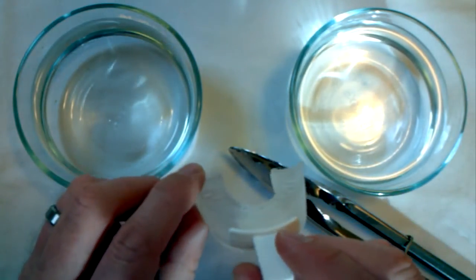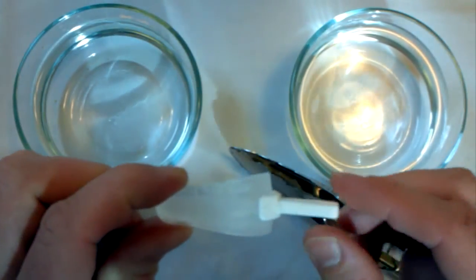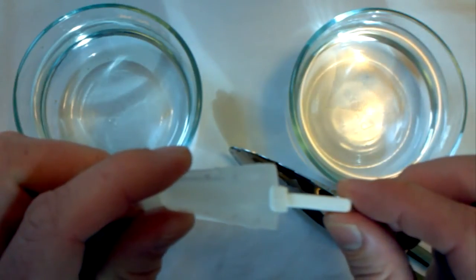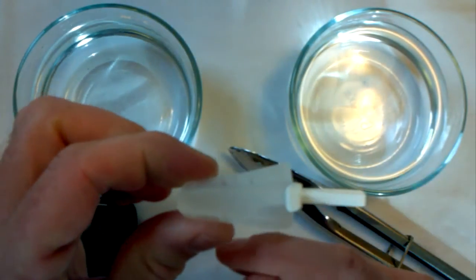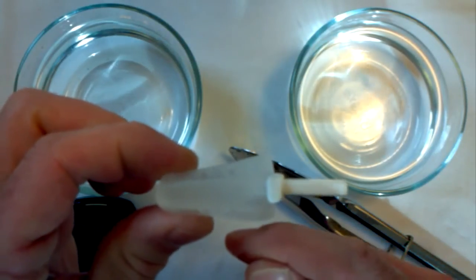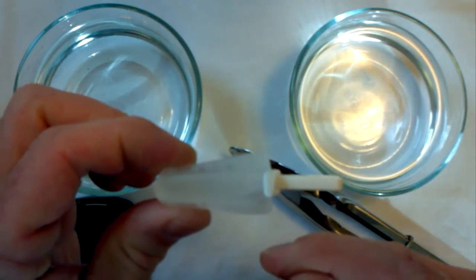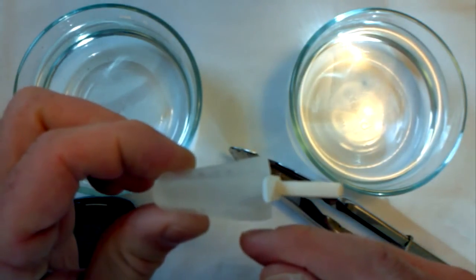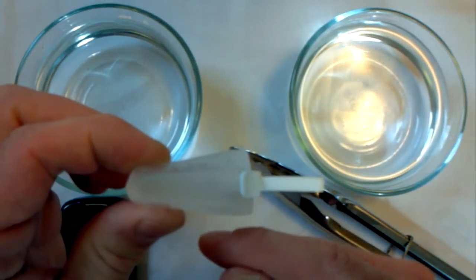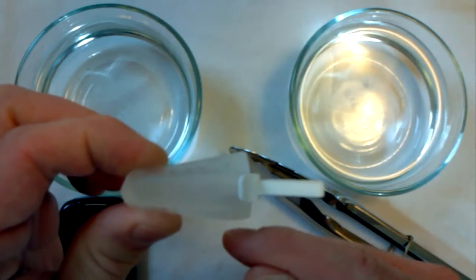So you're going to take this mouthpiece, put it inside your mouth, and look into the mirror. And what you're going to do is bite down firmly on the mouthpiece while moving your lower jaw forward slightly. And this is very important because without moving the lower jaw forward slightly, you're not getting any advancement as far as your lower jaw. And that's how these devices work. So it's very important that you push forward slightly and you bite down firmly.